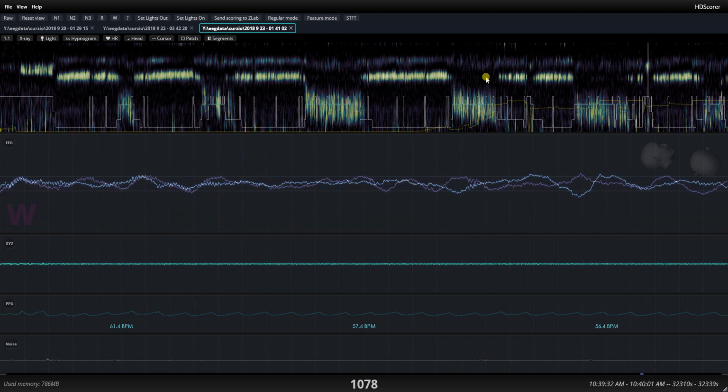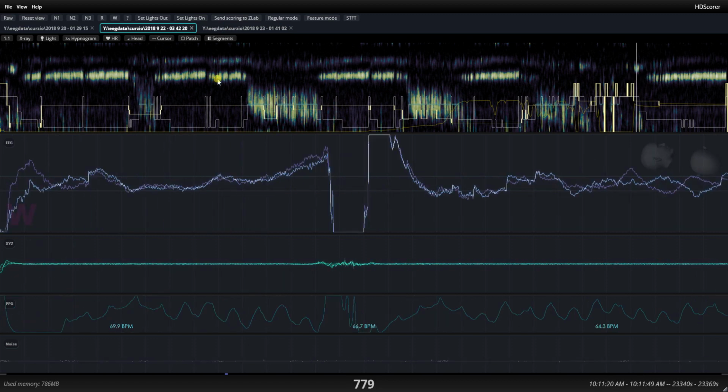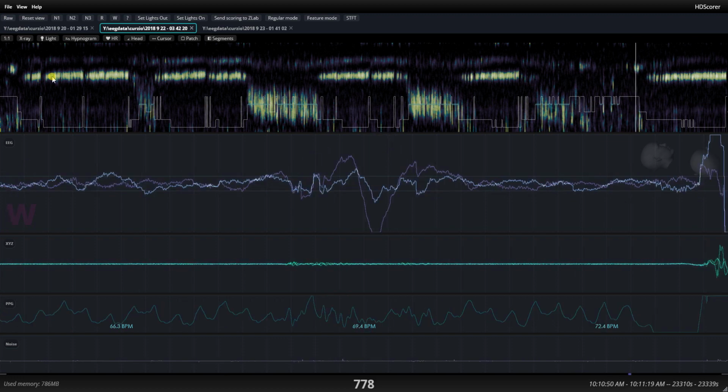That's a big one. For example, to know that, where can I find that same kind of intensity? I would have to move to a different record. Let's see if I find an example. Well, here's the same kind of intensity, and it's also alpha. Let me remove the head position because it's too much clutter. Let's also remove the light envelopes. It's useless here.